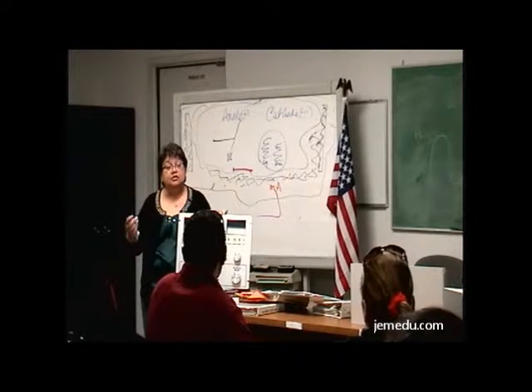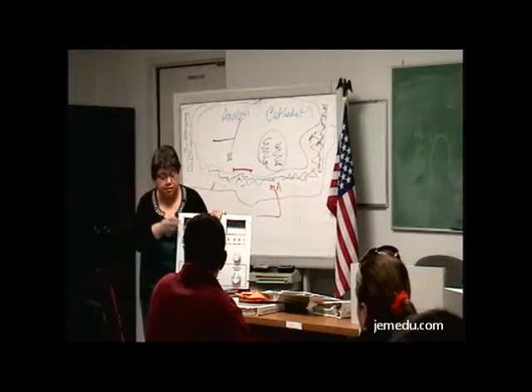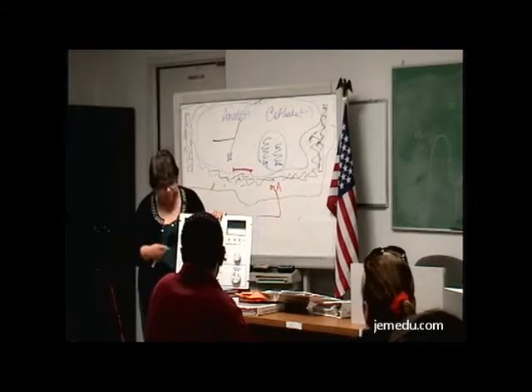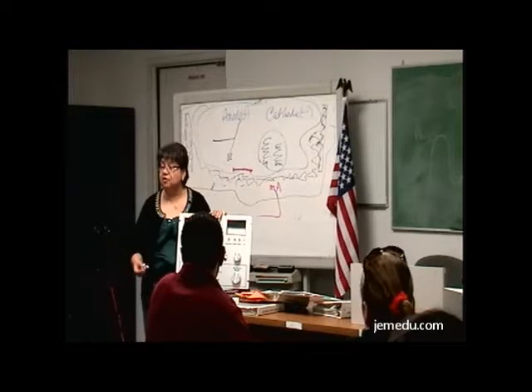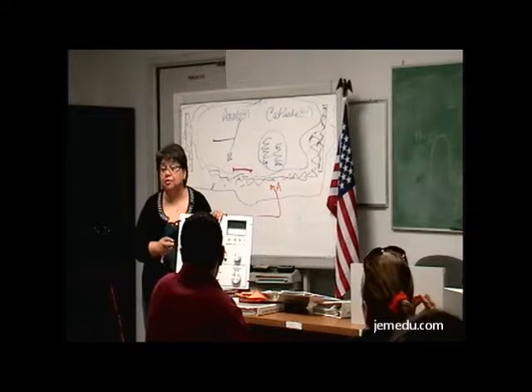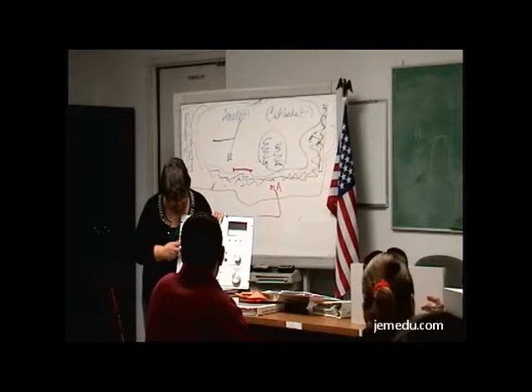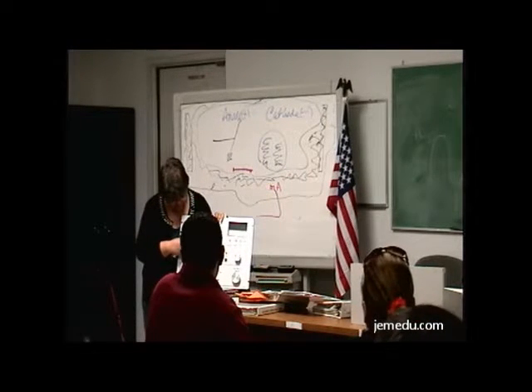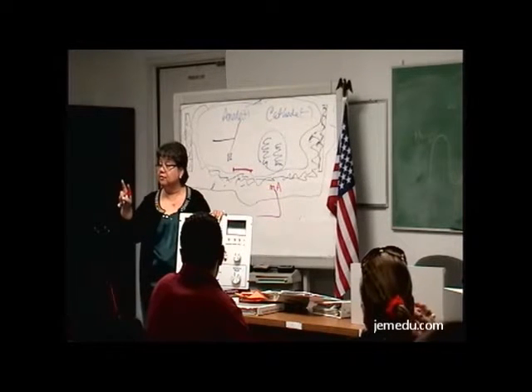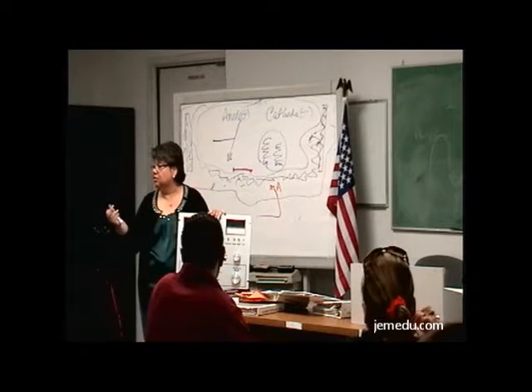So if you're using the lower end selections on your unit, on your X-ray console, so if I use 100, I'm using my small filament. And this one actually even tells you. Some X-ray consoles will actually tell you whether it's a small or large, some don't, and you're just going to have to figure the low ends are small. But this one has 100, I said earlier, 150, and then it jumps to 150 large. So I have two 150s, but I can use 150 milliamps on the small or the large for this console, which is kind of nice to know.